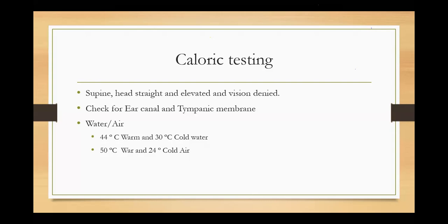The speed of the water is also controlled, because if you're gushing the water, then it will tear the tympanic membrane. And if you're blowing very heavily, it will also tear the tympanic membrane. So it's all under control. It's a slow introduction of this air or water. In case of a perforated tympanic membrane, we can use air.